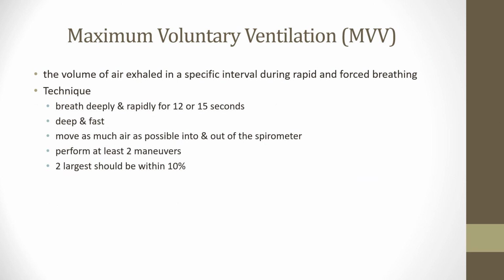Okay, MVV, this is a different type of test. This is the volume of gas that is exhaled during rapid and forced breathing. So this one's fun. You're going to breathe really deep and really fast for about 15 seconds, right? Pause it and try it, but make sure you're sitting down. Really fast, really deep, move as much air as possible in and out as you can. We need to do this at least twice, so make sure they don't pass out, make sure they recover, and then go ahead and try it again. But we need to do it at least twice.